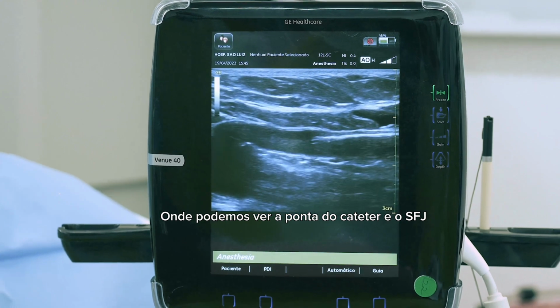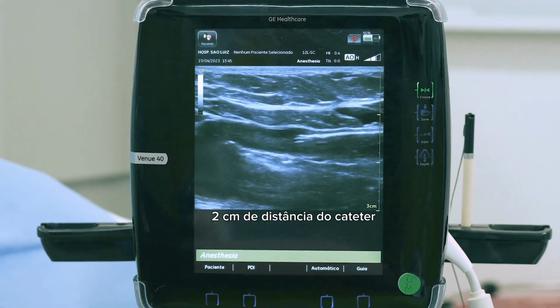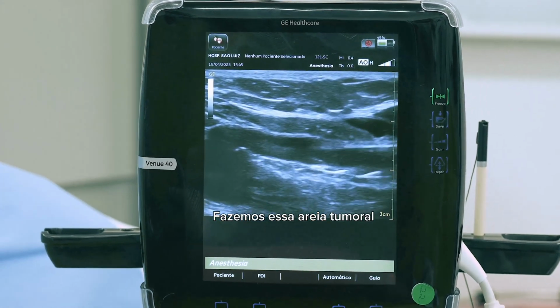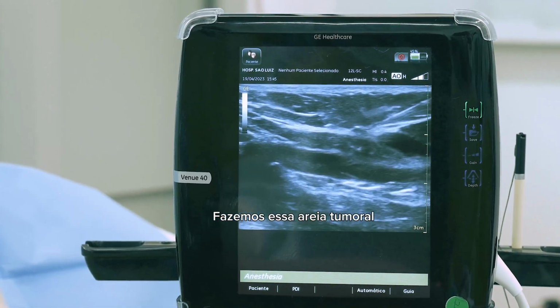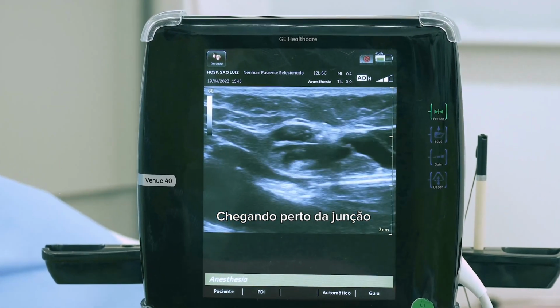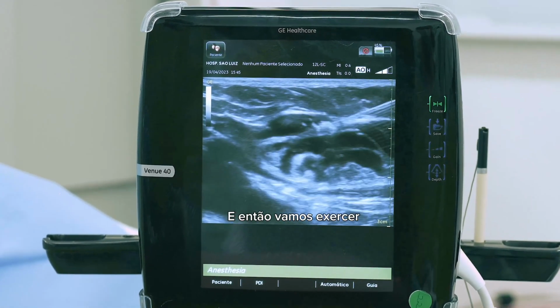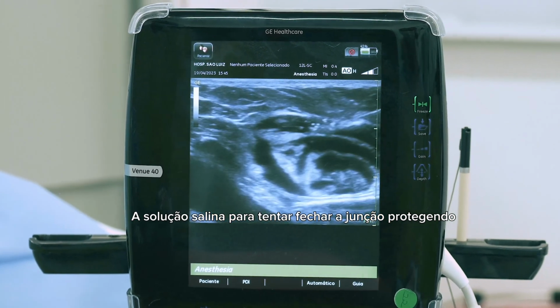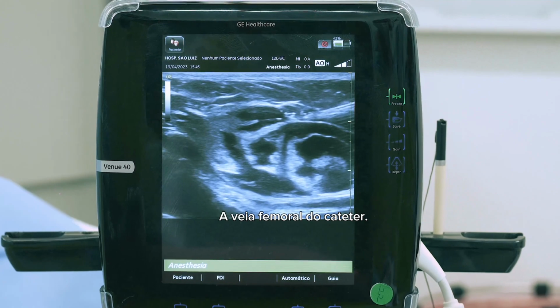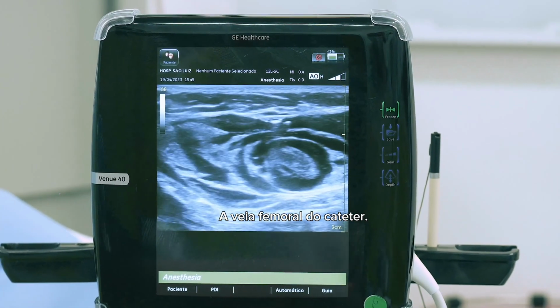The last tumescent injection we prefer to do in the longitudinal way, where we can see the tip of the catheter and the SFJ, 2 centimeters away from the catheter. We do this tumescent looking at the knee, coming close to the junction, and then we insert the saline to try to close the junction, protecting the femoral vein from the heat of the catheter.